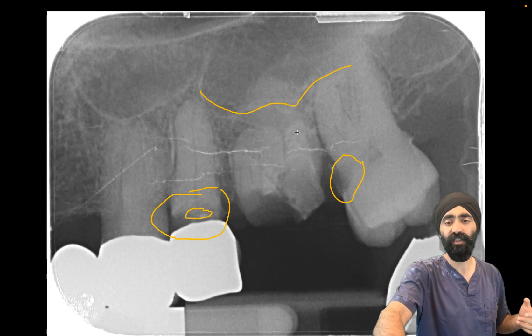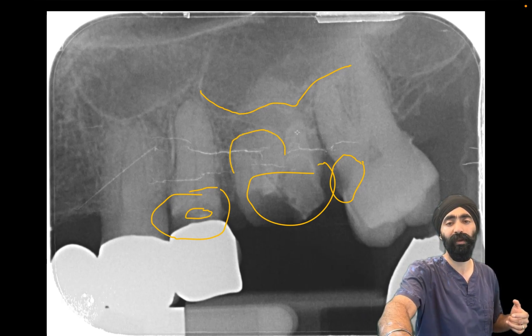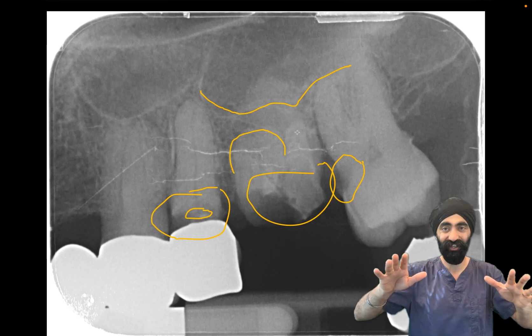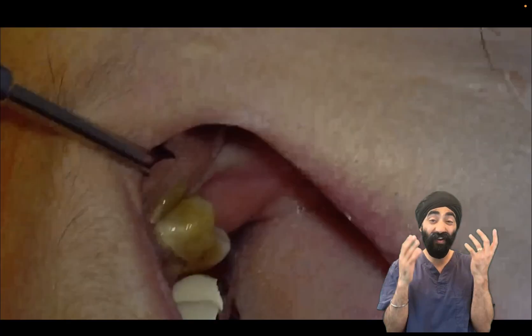Some of the challenging things here is that this is all mushy caries, and we see this nice thick bulbous root of the mesial — so I'm definitely going to be sectioning. Here's the clinical video of the extraction: upper left first molar, very carious.